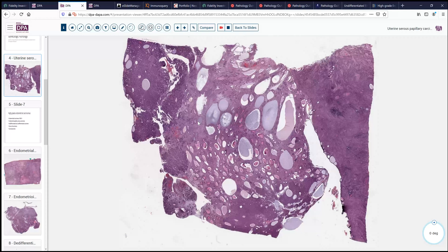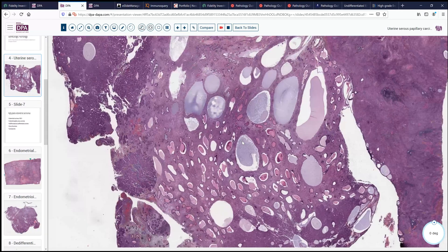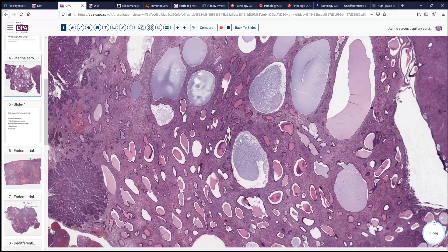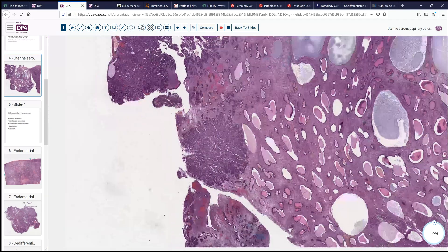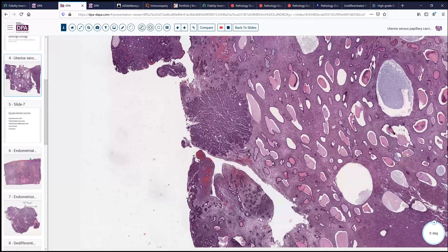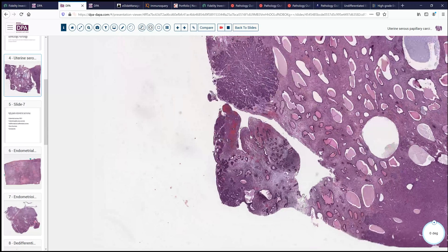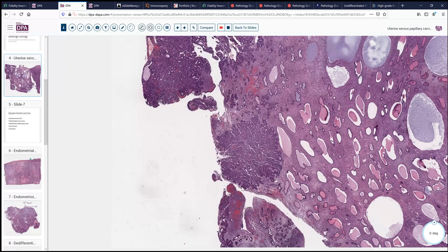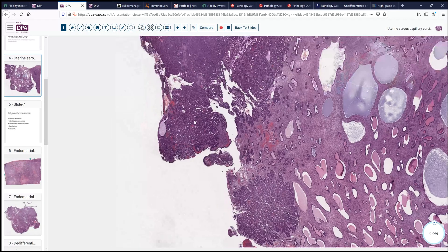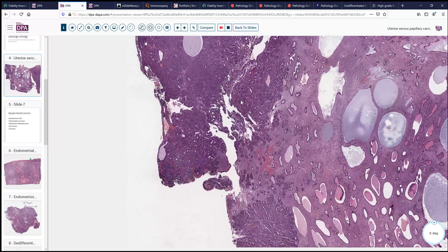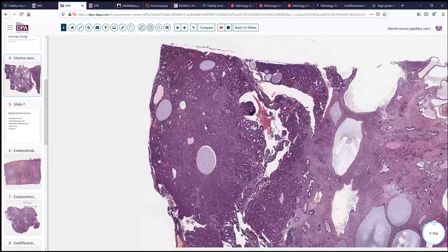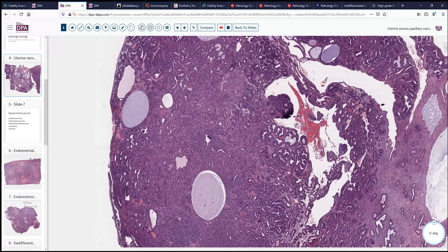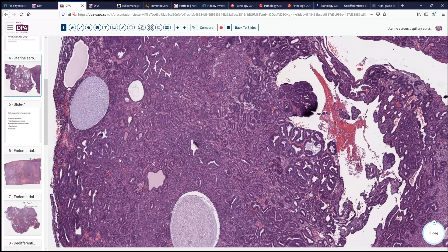Most of this polyp looks fairly bland with large dilated spaces, typical of an endometrial polyp. However, on the surface we see a characteristic finding of some more condensed, closely packed glands, hyperchromatic tissue areas, and a jagged irregular contour to many of these glandular structures along the surface of the polyp. This is a typical scenario that may occur in older women with this neoplastic proliferation as part of the polyp.